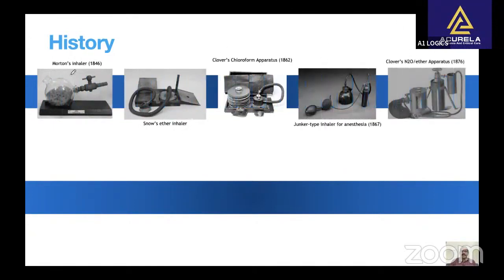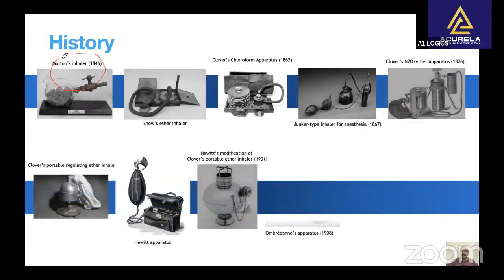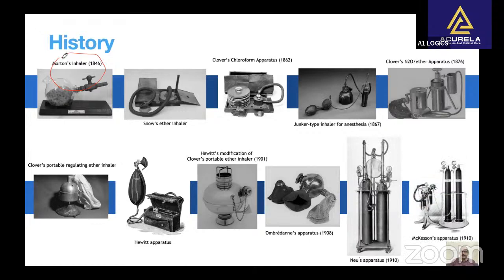The first anesthetic machines appeared following their public demonstration by Morton in 1846. These initial devices were simple inhalers based on the evaporation of the anesthetic agent. At the beginning of the 20th century, gas machines emerged, facilitating application of an anesthetic flow independent of the patient's inspiratory effort. These machines incorporated technological advances such as flow meters, carbon dioxide absorption systems, and fine adjustment vaporizers.